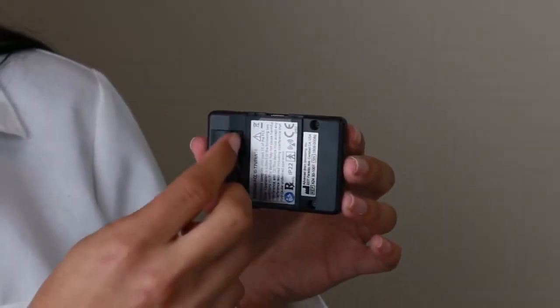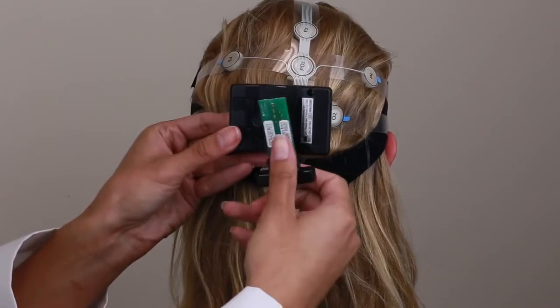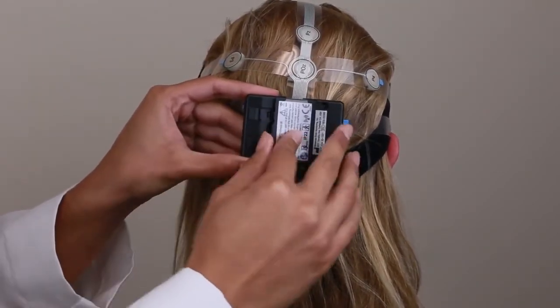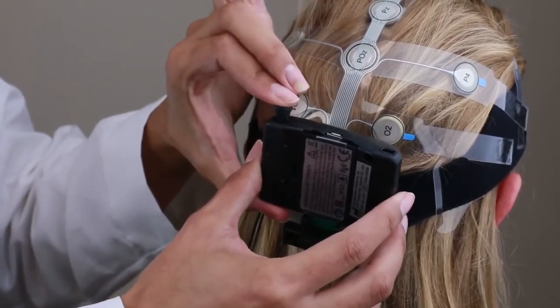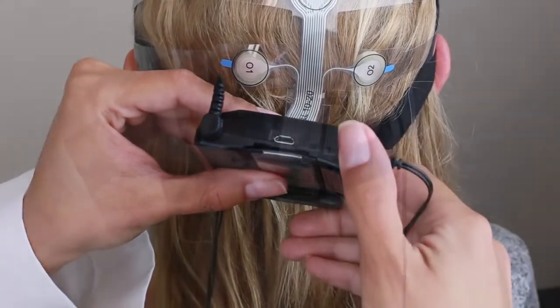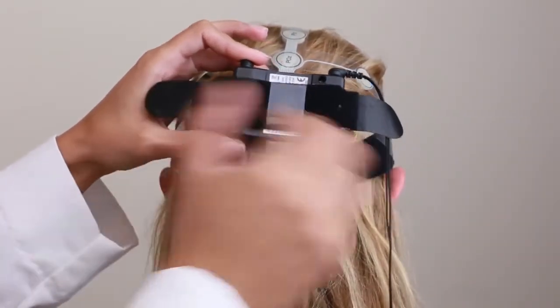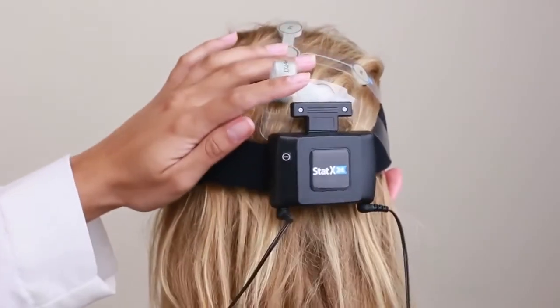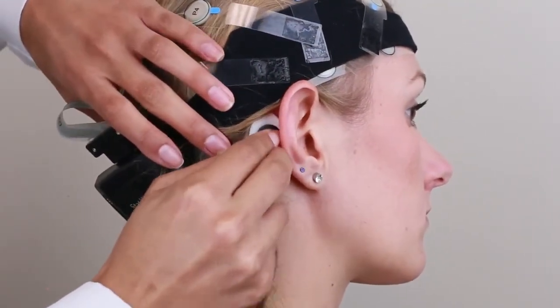You are now ready to apply the device. With the device in your hand, remove the door by unlocking the two latches. Hold the device with the USB facing up and flip the strip upwards. Align the connector with the underside of the device. Carefully and firmly connect the two pieces. Place the door back onto the device ensuring both latches lock. Connect the linked mastoid leads to the three-pin connector on the device. If you are using the ECG leads, connect them to the two-pin connector opposite to the mastoid leads. Slip the small neoprene strap through the clear plastic loop with the fuzzy or Velcro side facing away from the participant's head. Holding the two ends of the small strap, flip the device downward so it's right side up. Attach the Velcro on the device to the other neoprene strap on the participant's head. Move the device slightly to the right in order to minimize bending of the strip. Ensure that the strip is laying flat on the head and is not creased in any areas. Connect the linked mastoid leads to the mastoid electrodes behind the participant's ears.